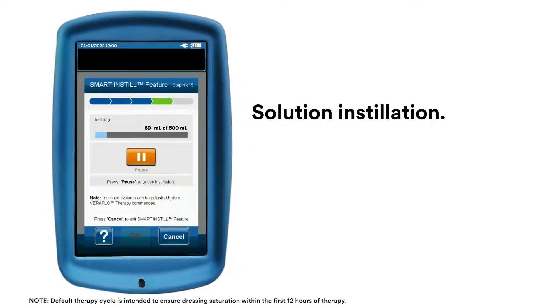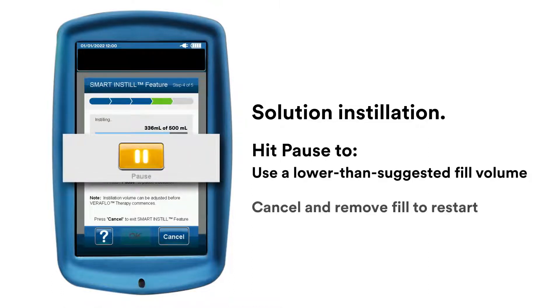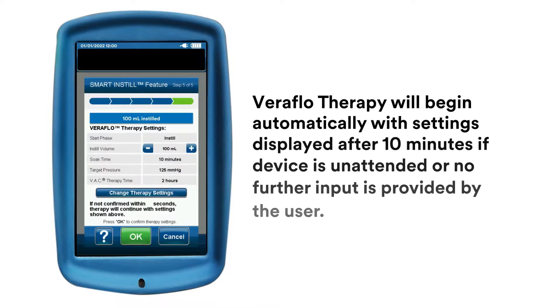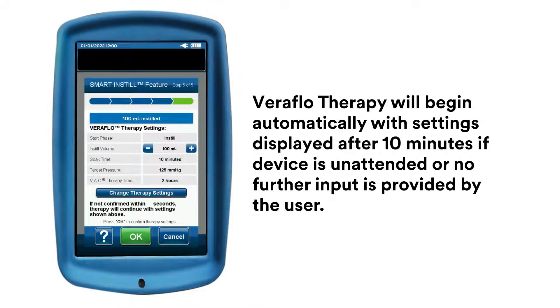The Smart Instill feature instills the estimated fluid volume. Please note, the default therapy cycle is intended to ensure the dressing is saturated within the first 12 hours of therapy. You can hit Pause at any time during the instillation process if an adjustment is needed. Once complete, you'll see a Smart Instill feature confirmation screen with the amount of fluid instilled.